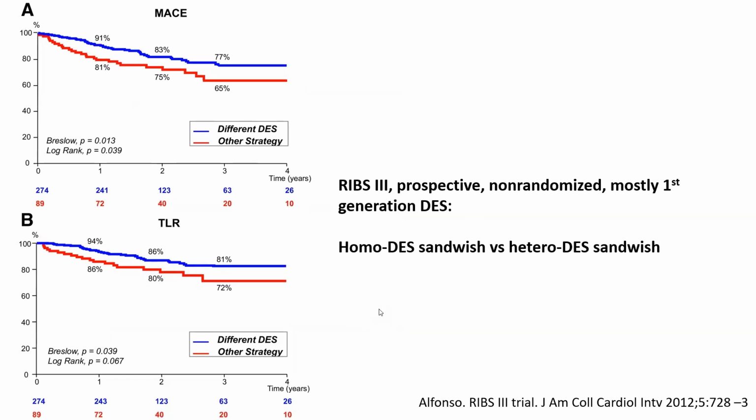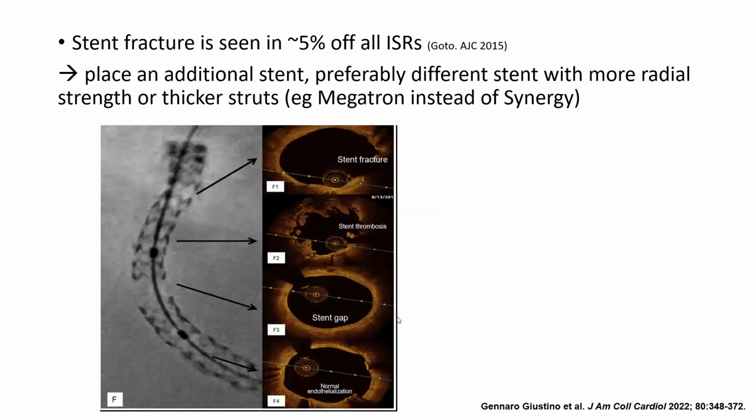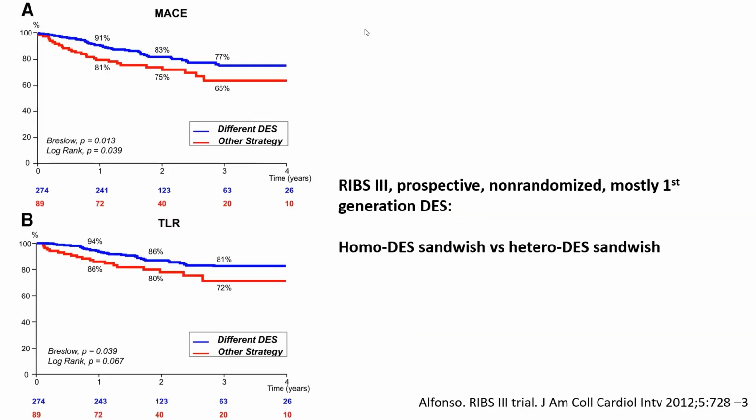This is another idea that comes up. Okay, well, when you put a stent inside an in-stent restenosis, what type of stent should you use? Should you use the same type of stent or should you use another one? No big data for that.